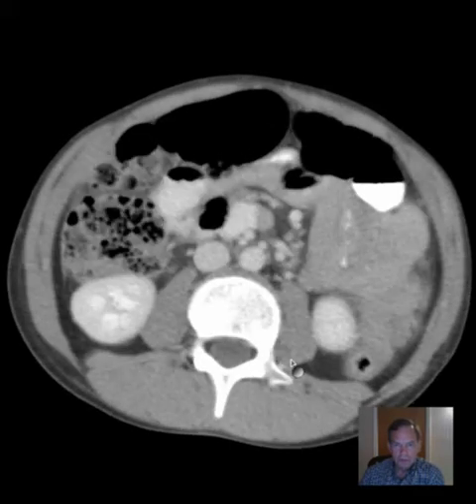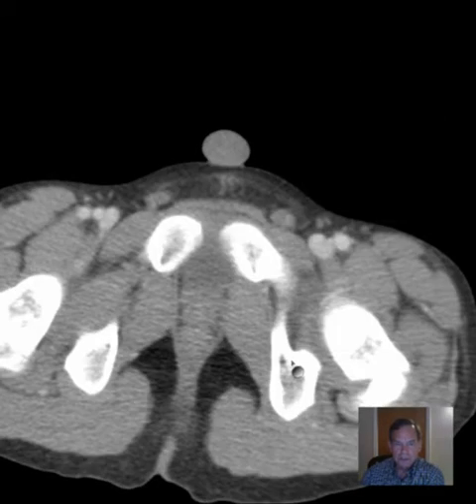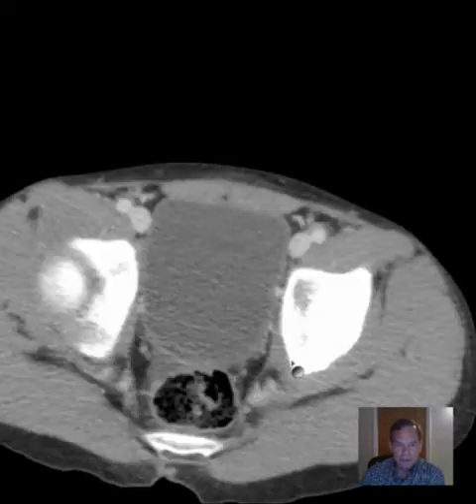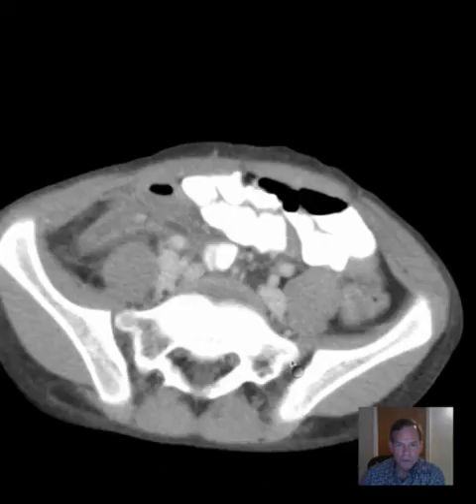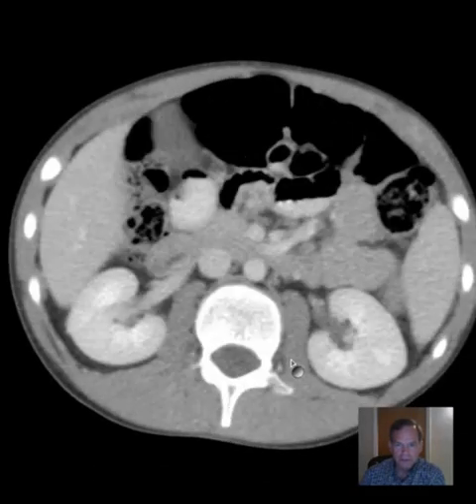Hello there, this is Dr. Mintz. This is a CT of the abdomen and pelvis in a patient with right lower quadrant pain and fever.